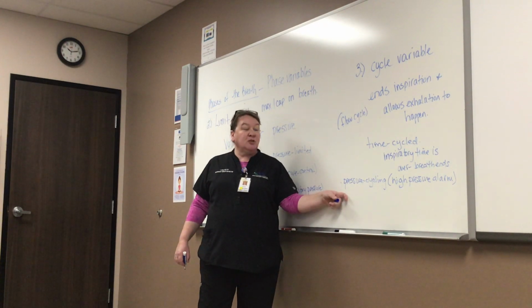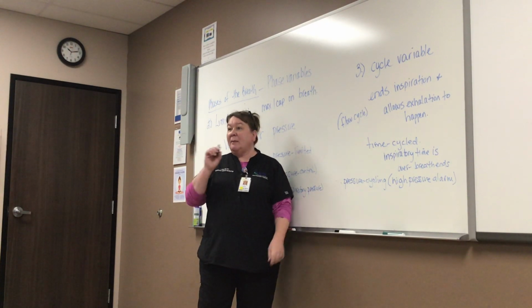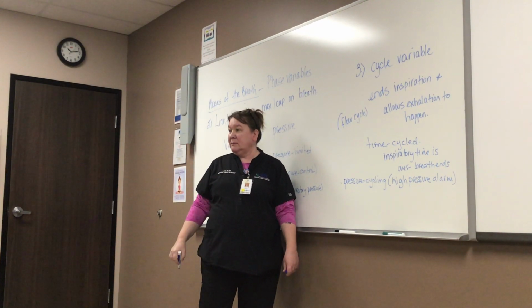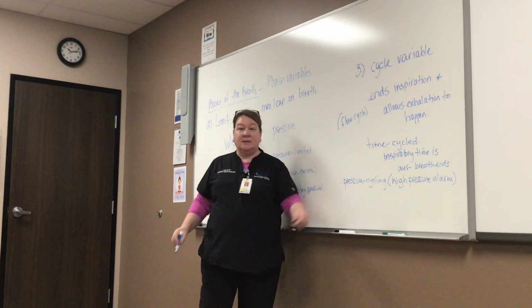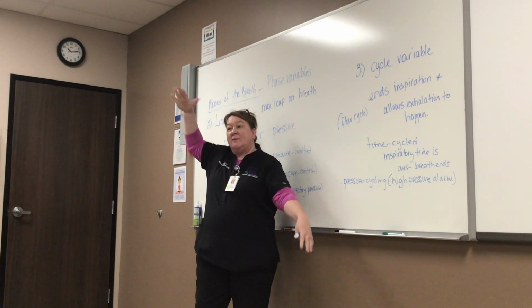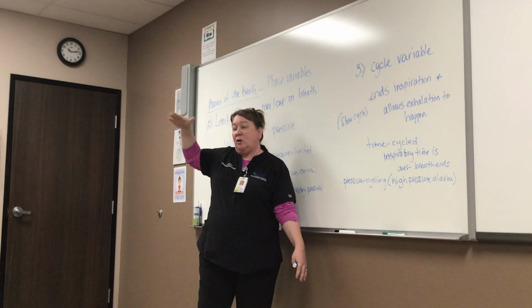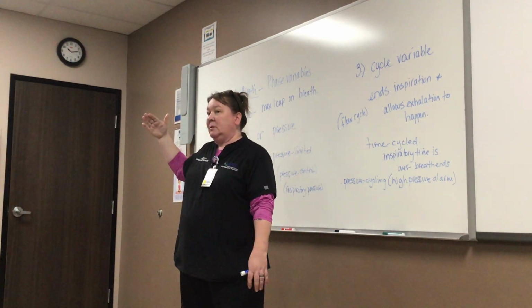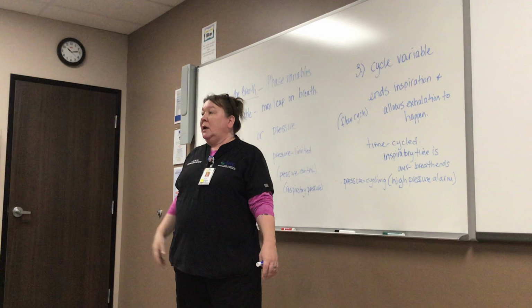So if I'm pressure cycling, that means as soon as I hit the pressure, the breath ends. So that's why I said it's the high pressure alarm. Because no matter what we do, we always have to have a cap on the pressure so we don't hurt our patient. Because what happens if the pressure's too high? What are we going to do? Cause a pneumo. And we don't want to do that.